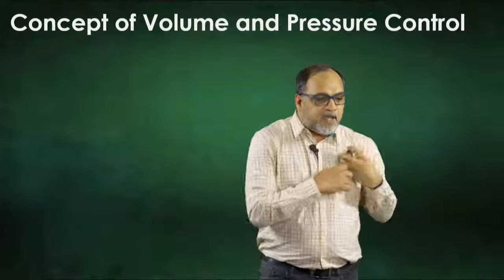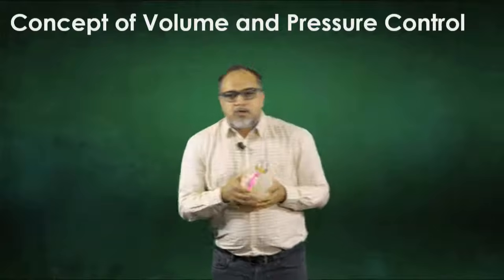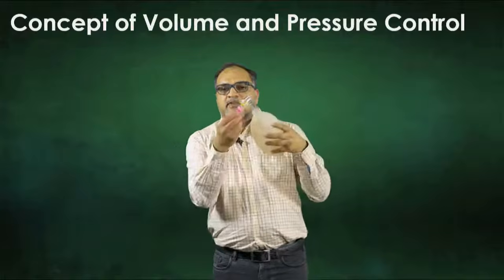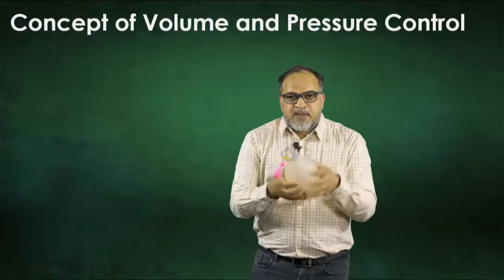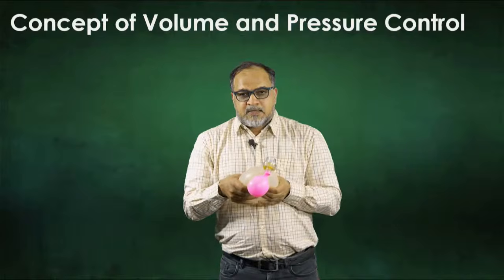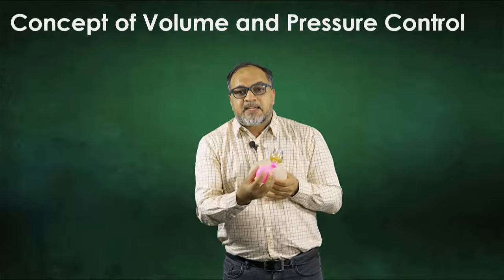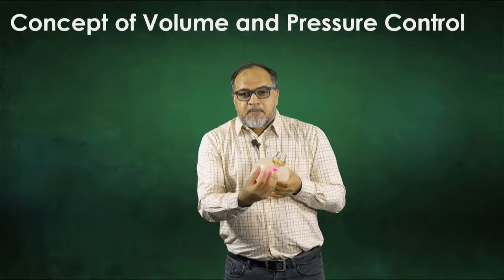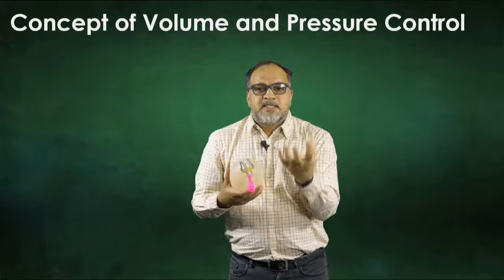I'll explain this with an ambu bag. So this is an ambu bag with a hypothetical lung attached to it. Whenever I ventilate a patient with this, the air goes inside the lungs and this balloon gets tightened. The walls of the balloon are experiencing some pressure.